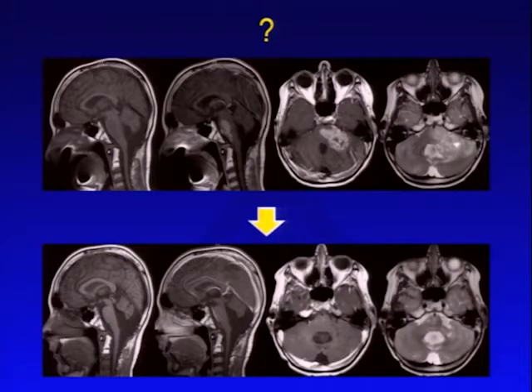If you look here at the signal intensity of the skull base, of the bone marrow, you know radiotherapy was performed. And this would have been my question, which I'm not taking out here. But you see in follow-up imaging, it resolved spontaneously. So this is just this very extensive reaction which you can have based upon radiotherapy, and it can confuse you.